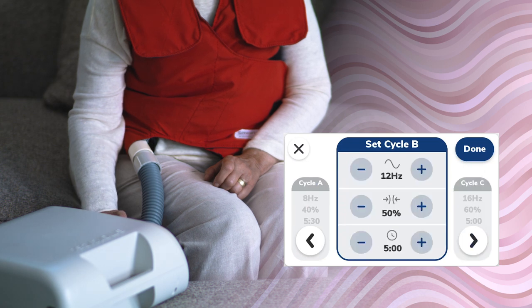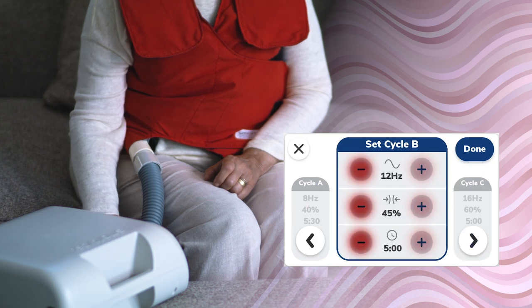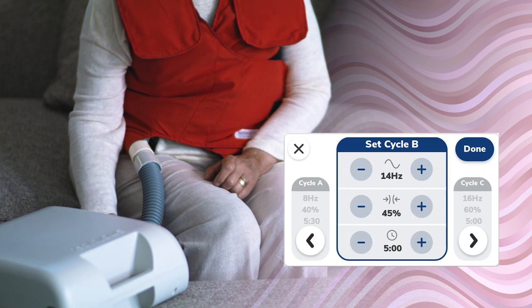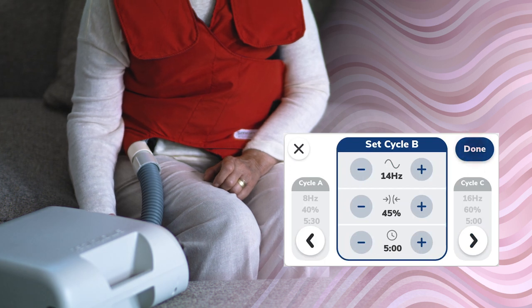To add another cycle, tap the plus button. Adjust the frequency, pressure, and time by using the plus and minus buttons, as was done for cycle A. Once all cycles are added and settings adjusted, tap the Done button to save the program.